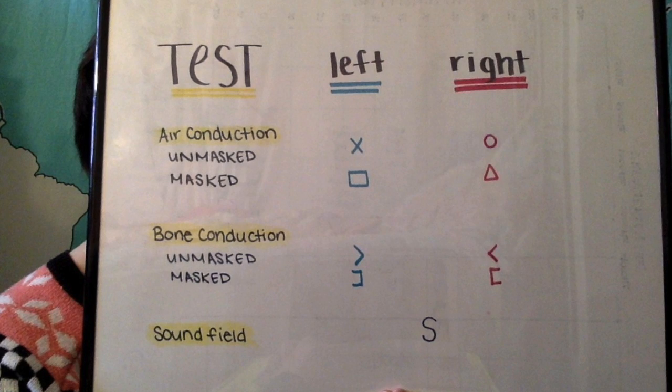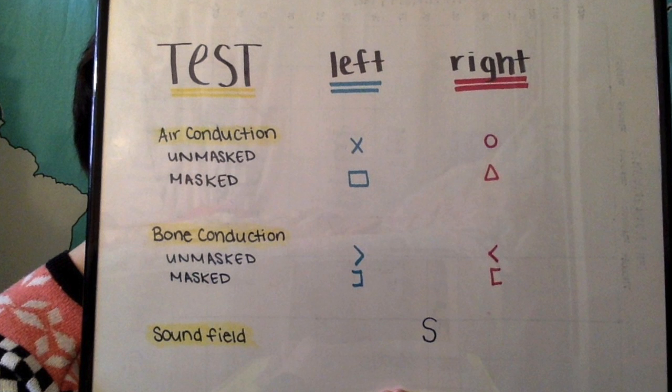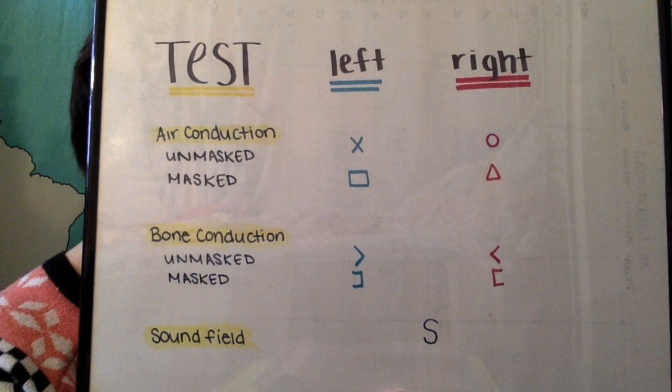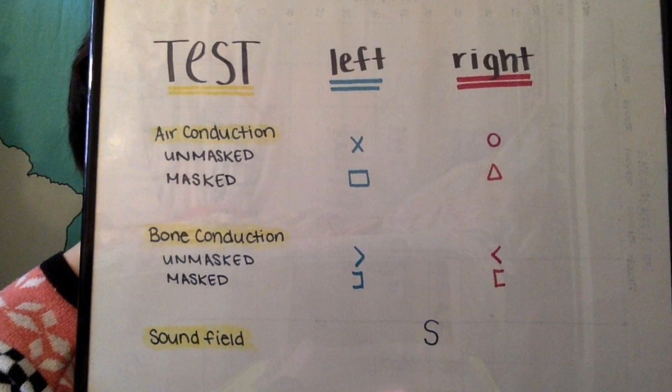The symbols used in the audiogram will correspond to the type of test and the ear that's being tested. Air conduction tests are the ones with headphones or ear inserts.